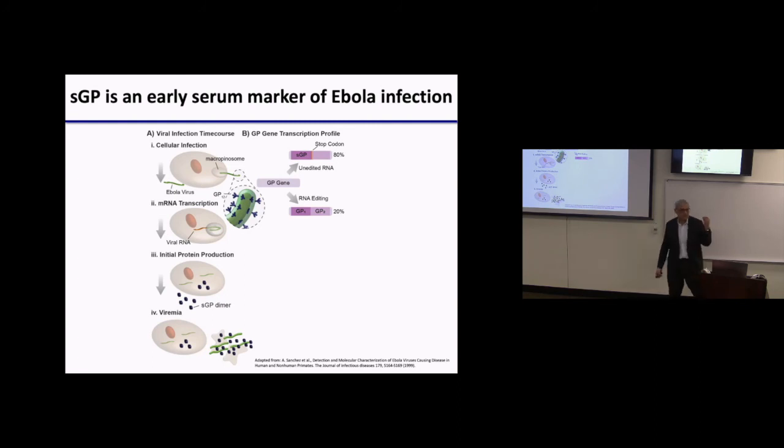So the first thing we're taking advantage of is the fact that the virus is doing amplification. And I use the word amplification because what we're going up against is PCR, right? So the most sensitive point of care test for Ebola is PCR, which is kind of crazy. They have to set up these tents. Everybody wears gloves and masks. PCR is very sensitive, but also sensitive to contamination. And you have to train people how to do this.